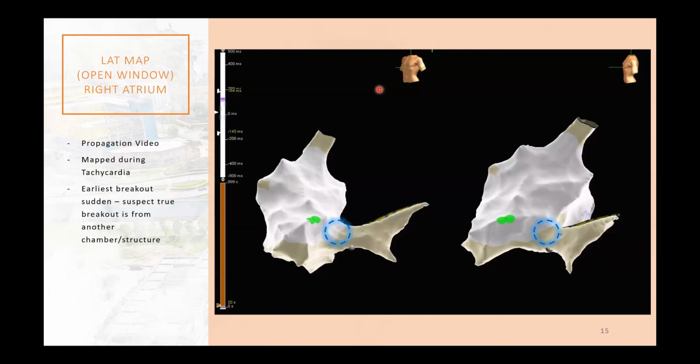But I'm not quite sure that the answer is still correct or not. So can you comment a little bit about this? Okay. So first the rule is that you do venogram. Yeah, we did that. MCV size has got to be larger than your ablation tip, so as not to occlude the flow.